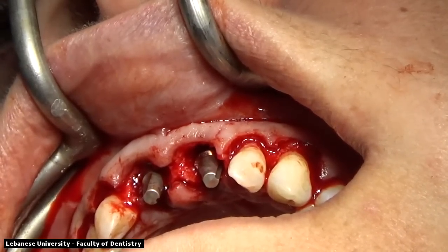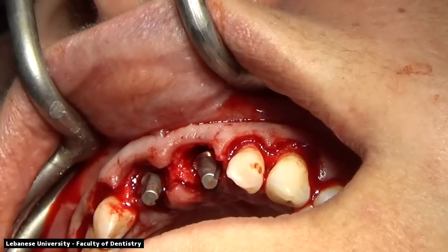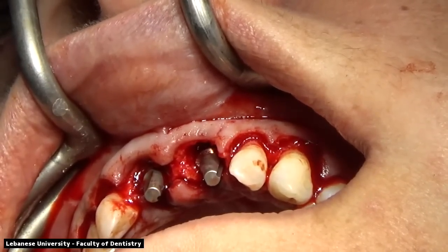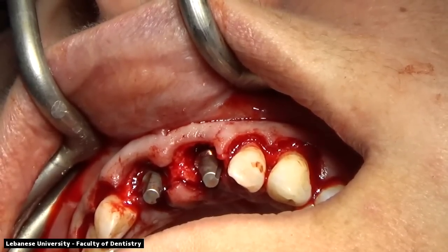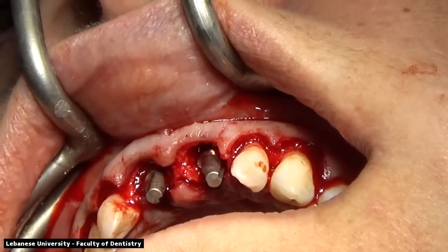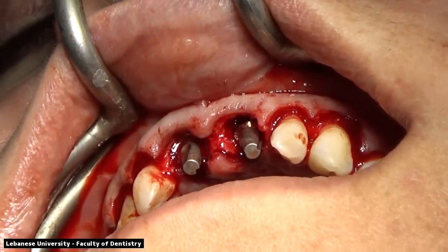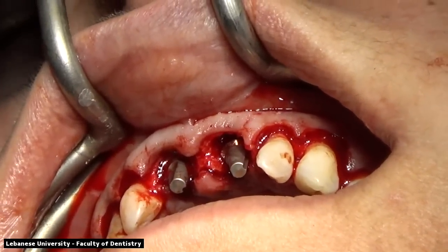The acrylic material is being mixed right now. We want a thick consistency so that we can get complete dryness of the material in a fast approach. All we're doing is relining the previously made shells, the temporaries that were made prior to the surgery.